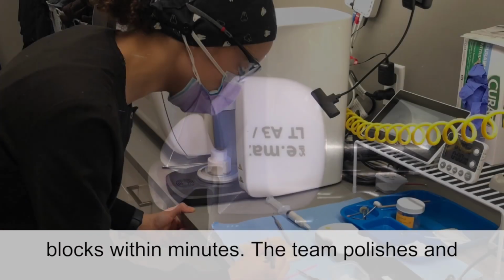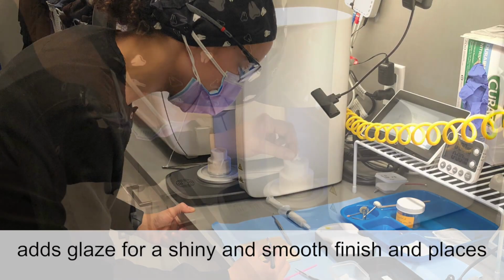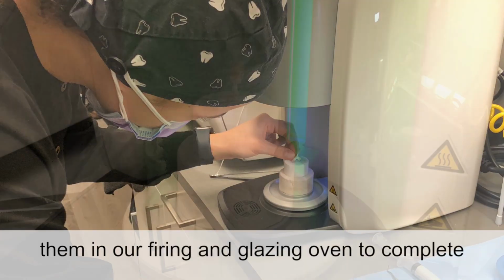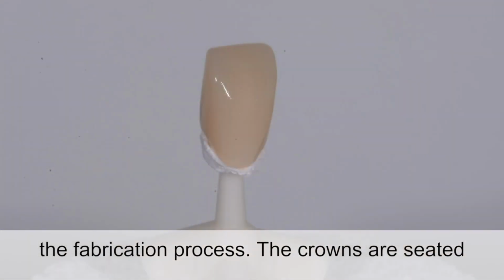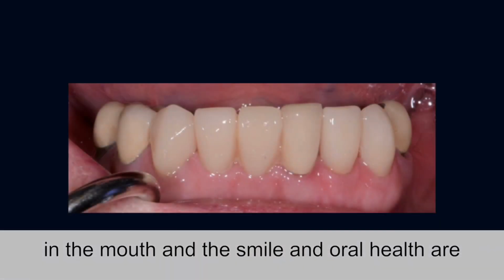The team polishes and adds glaze for a shiny and smooth finish and places them in our firing and glazing oven to complete the fabrication process. The crowns are seated in the mouth and the smile and oral health are restored.